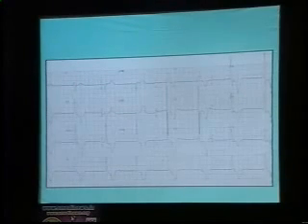Absolutely right. You see there is a right bundle branch block. V1 is right bundle branch pattern. You see lead 1 is negative. That means there is a left posterior hemiblock. So the patient has an underlying conduction system disease. And whenever you see atrial fibrillation, whenever the atria is fibrillating and the ventricle is at a fixed rate, there is no other diagnosis but an underlying complete heart block. You withdraw the drugs, but in most probability you have to give these patients a pacemaker and the patient improves magnificently.